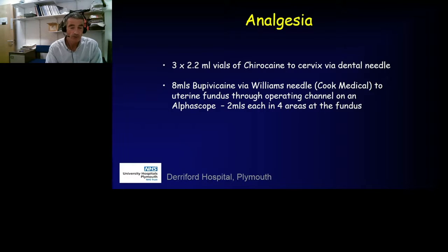Initially at 12 o'clock where the cervix is held, so that's nice and numb, and then injecting around the cervix. Often going in quite superficially to start with, injecting along the needle track, and then ending up with most of the anaesthetic going quite deep, I think is quite important. And that does work well. And injecting slowly works well.